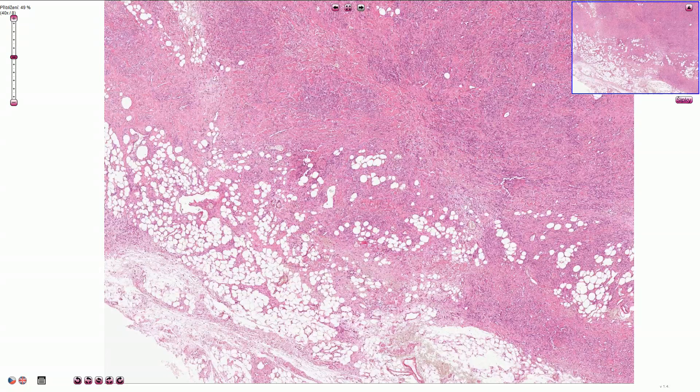Invasive lobular carcinoma is the second most common carcinoma of the breast. The most common is ductal carcinoma, or carcinoma of no special type.